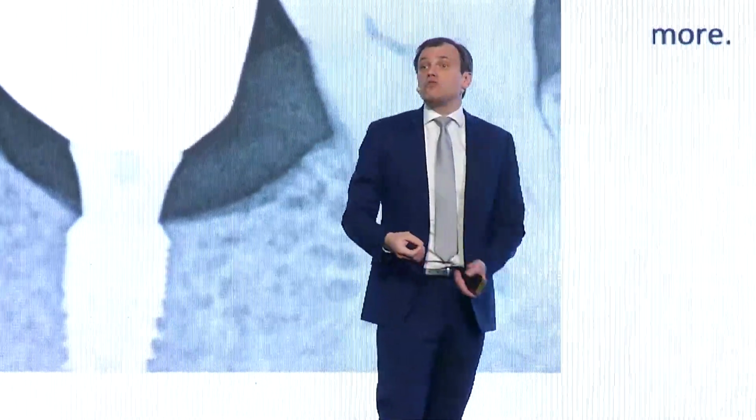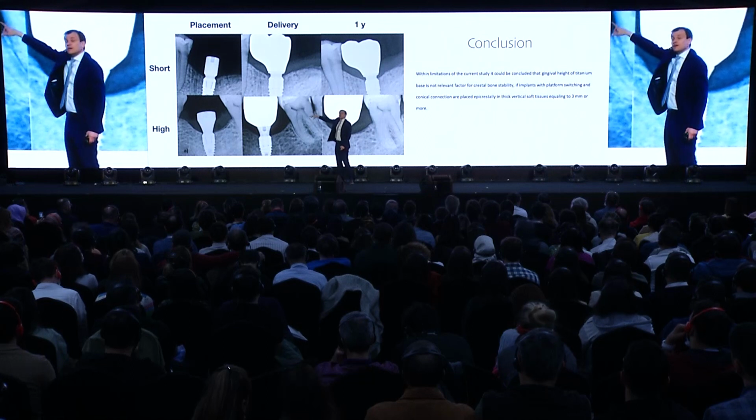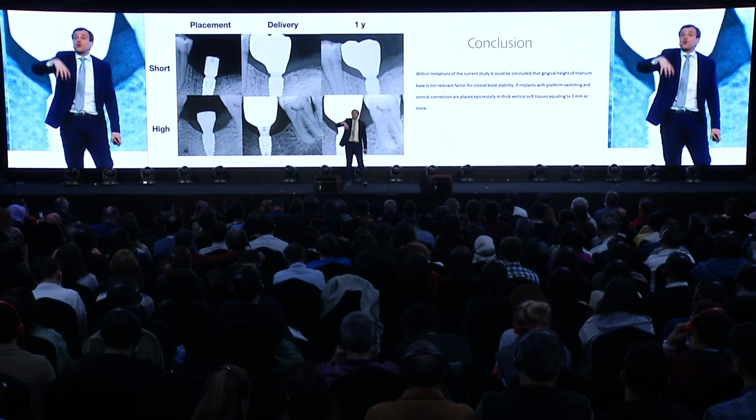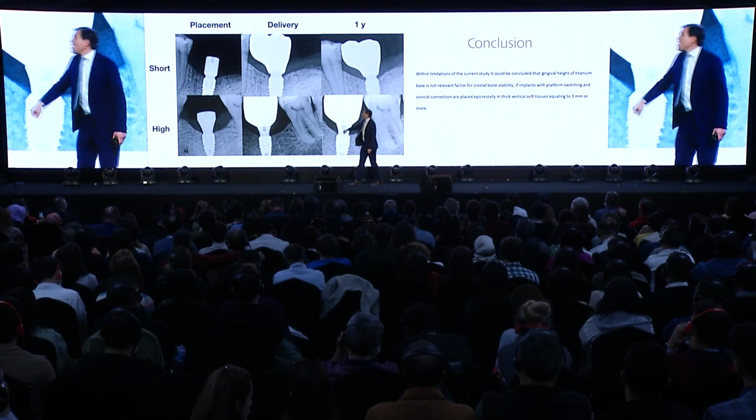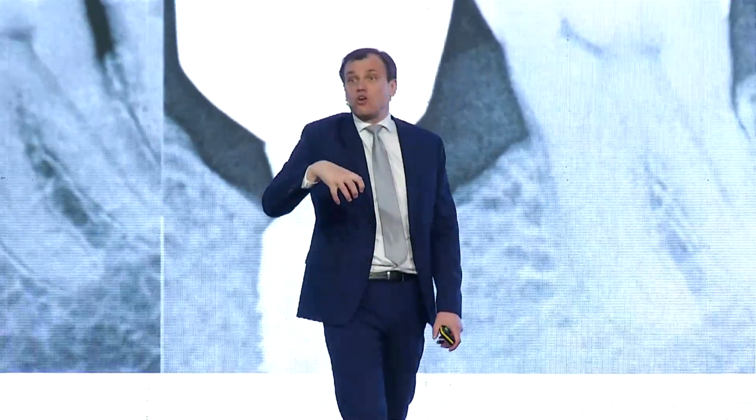The difference between using low and high tie base really will make sense when we talk about prosthetic material. We'll talk about, for example, zirconia, because if I am using low tie base, it means that I can have more zirconia below the tissues. And if I'm using higher tie base, it means less zirconia.